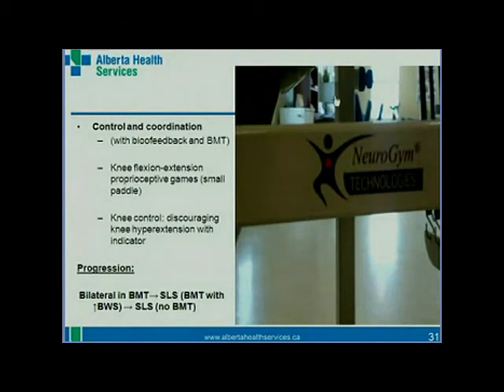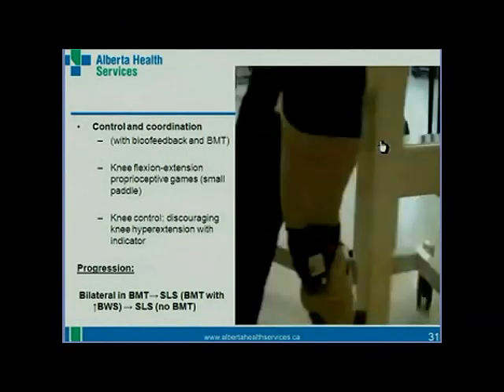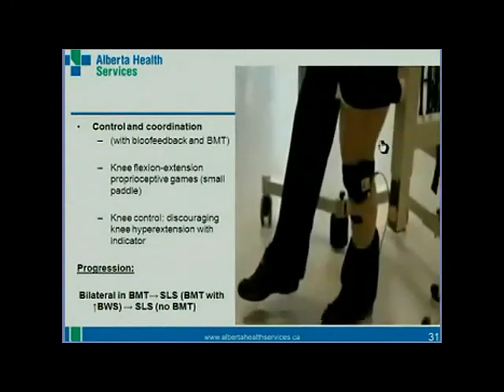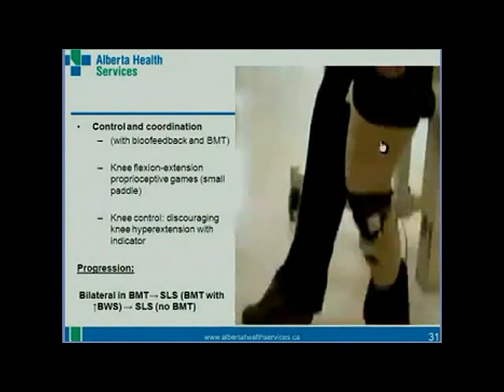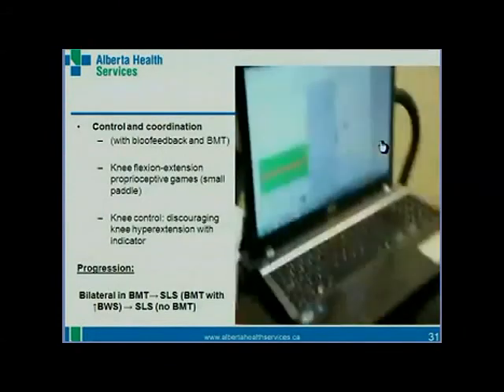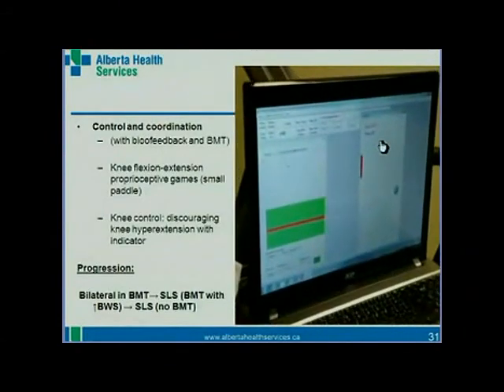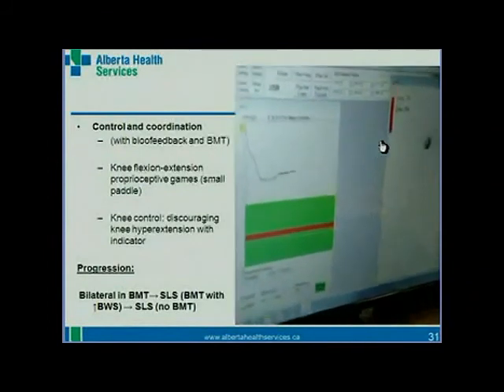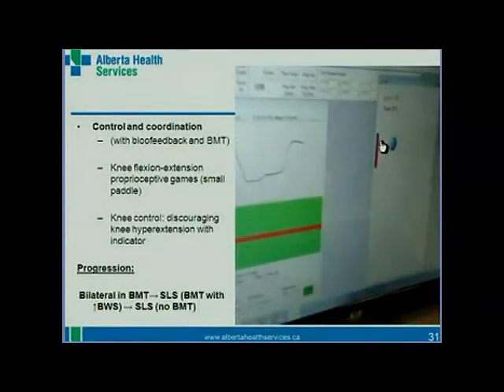And just because a video is always better than my explanation, I'll show you here. So with this client, we're controlling the game with knee flexion, very little. And I make sure each time if she goes in hyperextension, the game will stop and it will beep. So you see how proprioception of the knee can be trained like this. Okay, it's always the ping pong I use most of the time. It's not the most exciting game, but it's simple enough so the client can work. And there's nice progression to be done there, and that's what I did with the client.